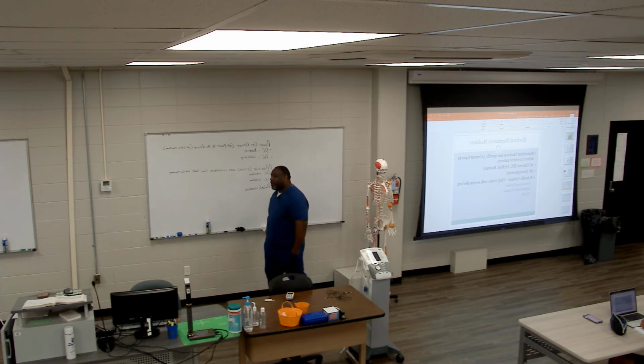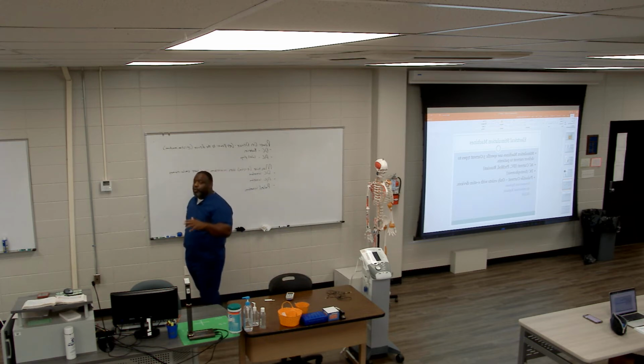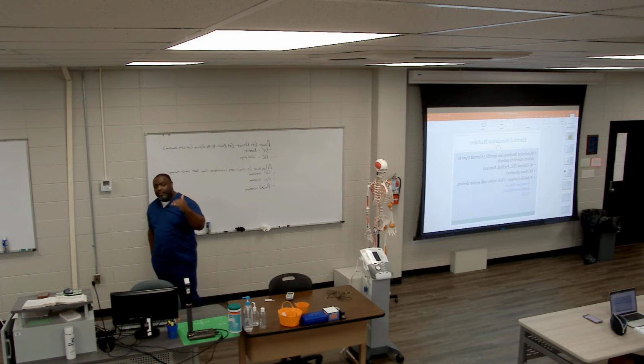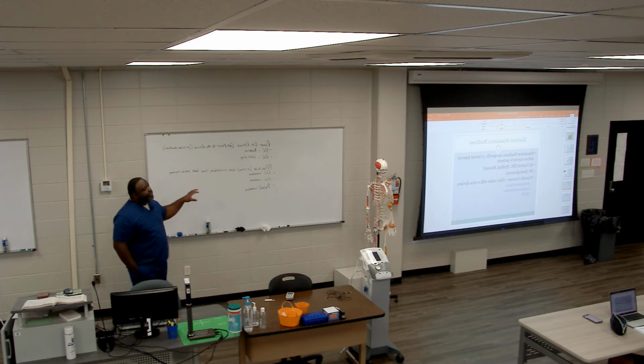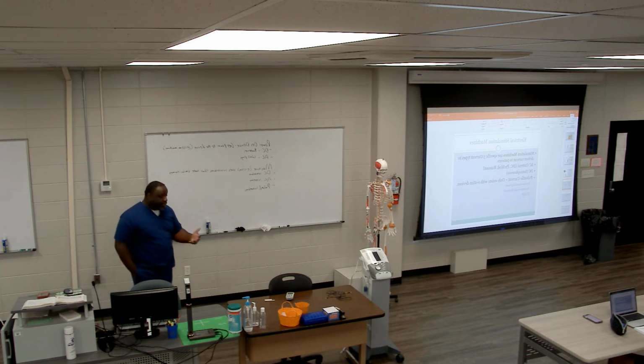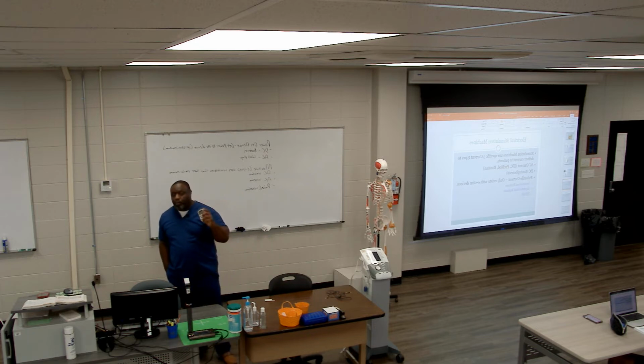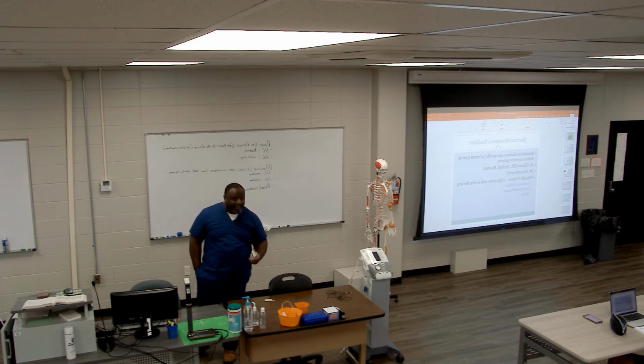So when we are selecting treatment types in the machine, we're picking specific waveforms. Some of them, as portable devices, will already have the waveform pre-selected.